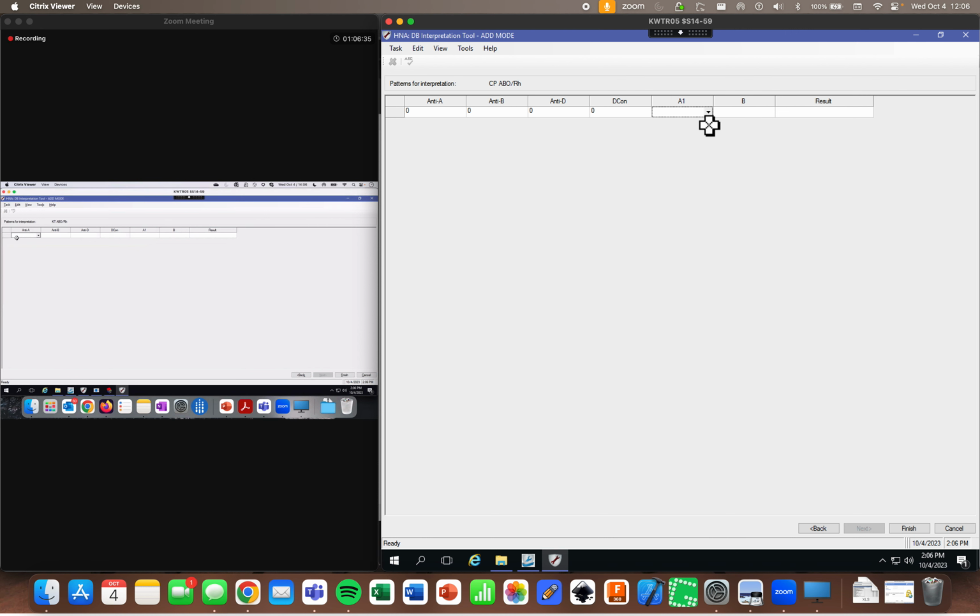So if you're like, where is she in all these numbers? It's in our book. So remember, if you want to type it in rather than having to click through each one of the drop downs, you're just going to hit the number. So like 0, enter, 0, enter, 0, enter, 0, enter, 1, enter, 1, enter. And then that would be O negative.